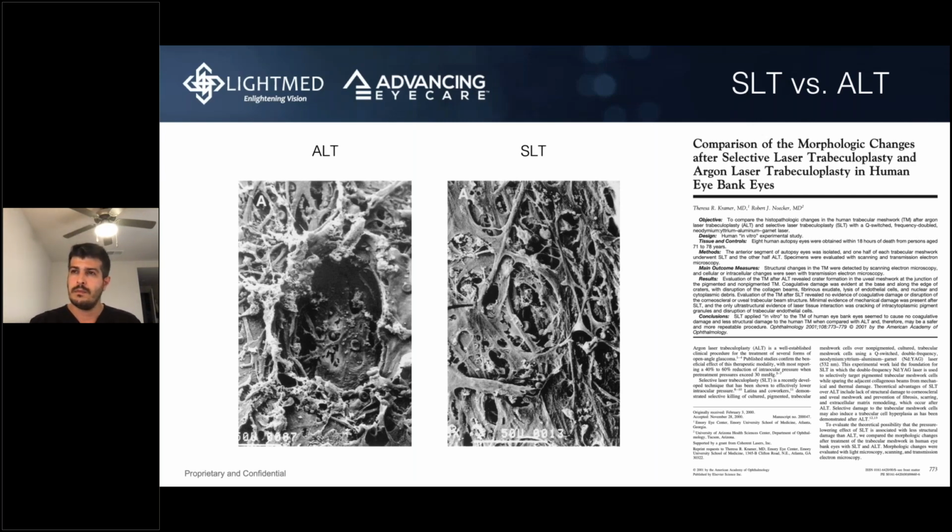Okay, what risks do you disclose in your consent? IOP spikes that might not be transient? For example, more pigment with persistent spikes needing surgical intervention. I would say that's really more of a theoretical risk than a practical risk. In our consent form, we say there's a risk of IOP spikes, but as ophthalmologists, we're well trained to manage IOP spikes. We have many different eye drops, and an IOP spike is exactly what it sounds like. It's a spike. It's not up there to stay there.